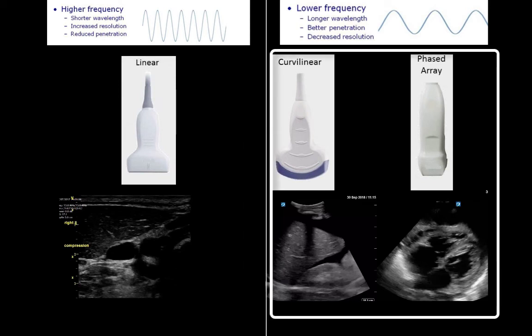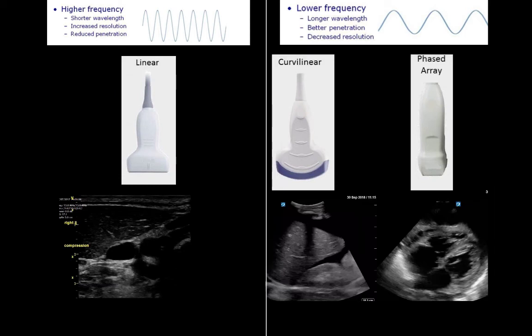On the right we see lower-frequency probes: the curvilinear and phased array. People often call the phased array the cardiac probe, but it is really a misnomer. The sequential crystal activation of the phased array is great for cardiac activity capture but can also be used for lungs, chest, and abdomen. In fact, the phased array probe is just a really small curvilinear probe. Even the curvilinear probe can be used for vascular and lung, particularly in patients with abundant soft tissue.